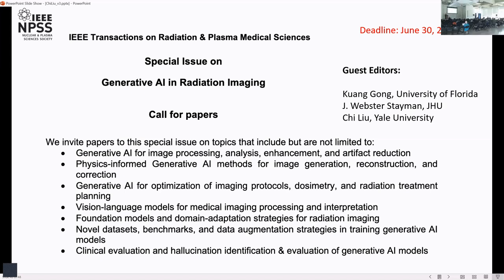Great. And perhaps one last quick question from Jyoti Chand. Are the denoiser and segmentation networks trained jointly? Right. In the first work I showed, the segmentation was trained separately. We train the segmentation first, and then feed the segmentation results into denoising. In the second part I showed, it is jointly trained, with simultaneous denoising and segmentation.